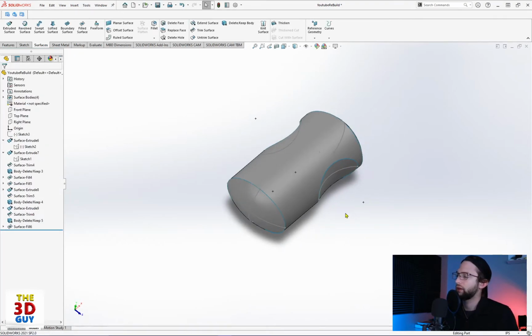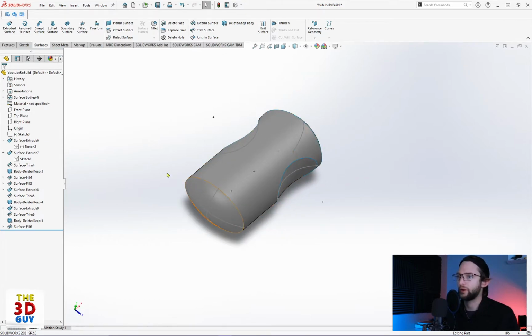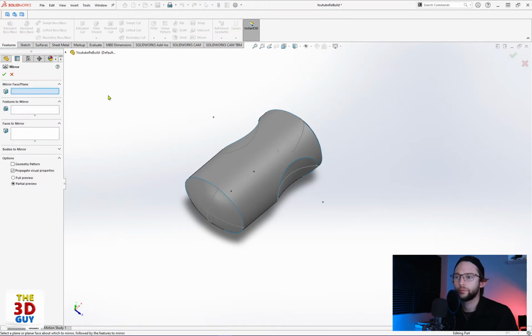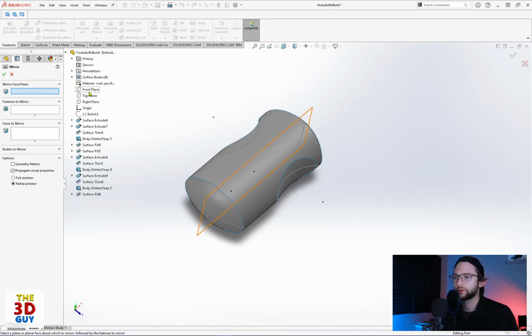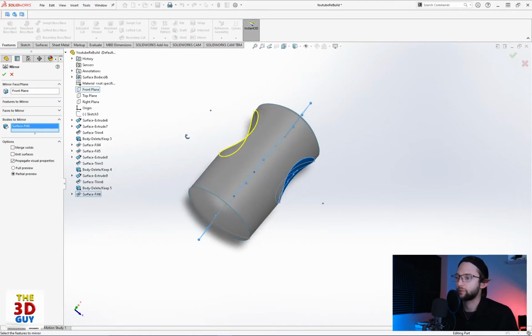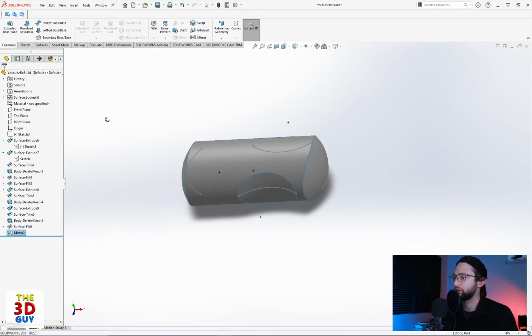Awesome. And then last, we're just going to mirror that right over. I know that will work. So we will mirror. We're just going to use the front plane. I'm actually going to do a body. Since all of these are separate surfaces, it's just going to recognize that as a separate body at this point, since none of it is stitched together. All right, that's it. We've got the shape.